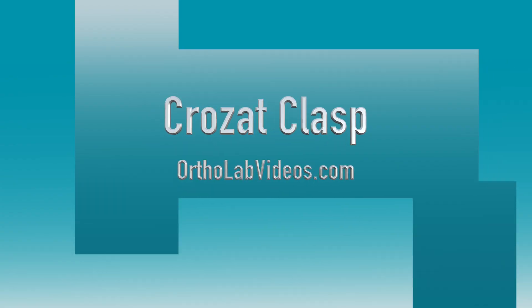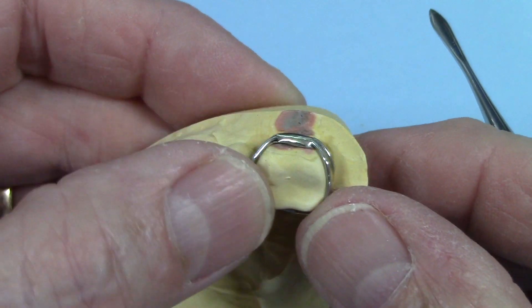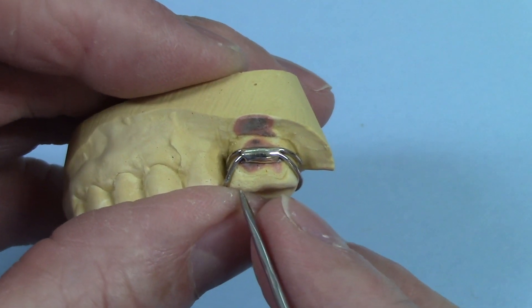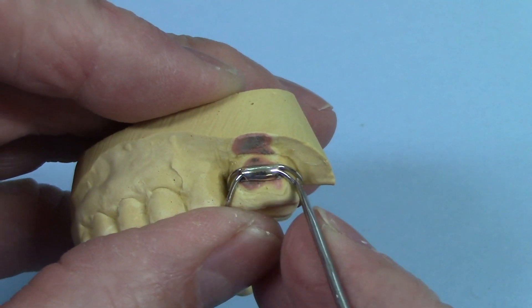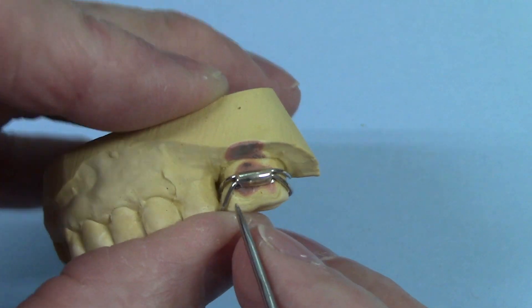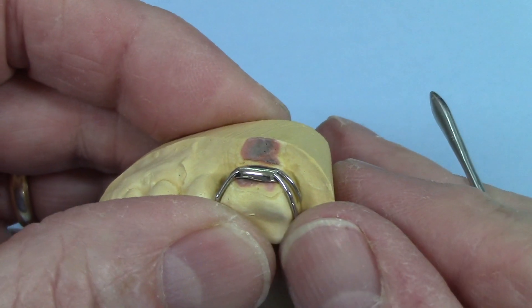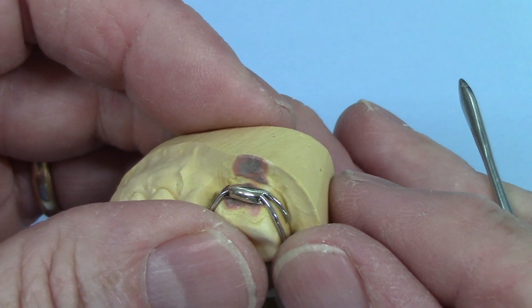Hi, I'm Jay Tyler. In this video, I'm going to show you some variations on the Crozat clasp. This is the basic Crozat clasp. It's composed of two components: a crib wire that goes around the tooth, and a crescent wire that tucks into the embrasures of that tooth, and that's where it gets its retentive value.